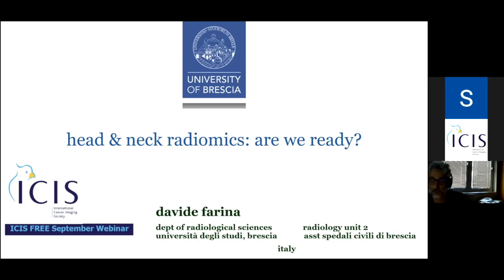Because many of these competencies are outside the perimeter of radiologists and outside my competencies. But I think that this is something we must be very aware of because radiomics could influence our near future. So what are we going to talk about?